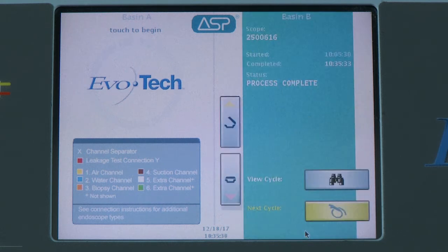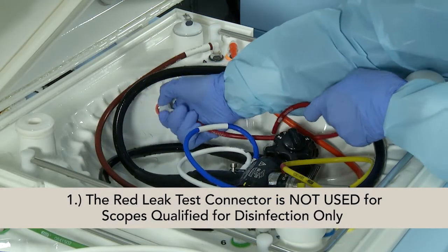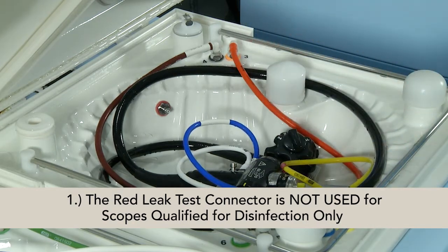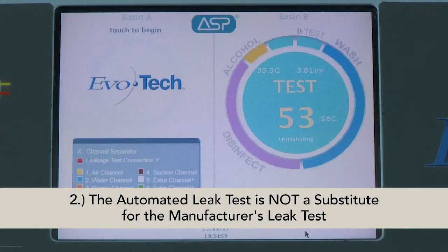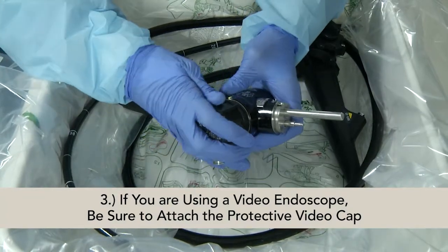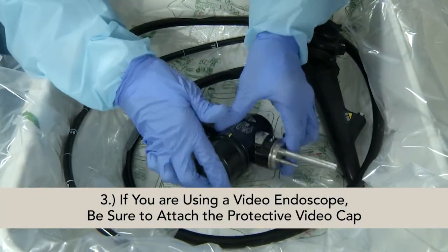Be aware of 3 key points regarding leak testing. First, the red leak test connector is not used for scopes qualified for disinfection only. Second, the automated leak test is not a substitute for the manufacturer's leak test. Third, if you are using a video endoscope, be sure to attach the protective video cap.